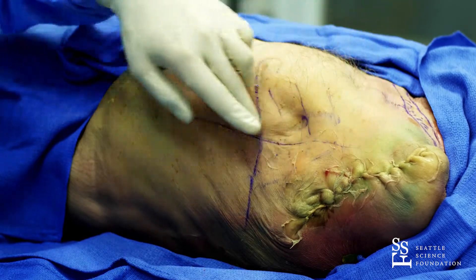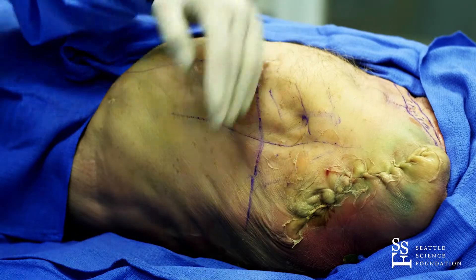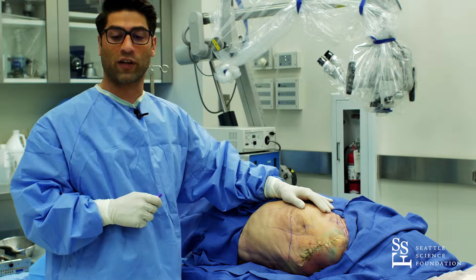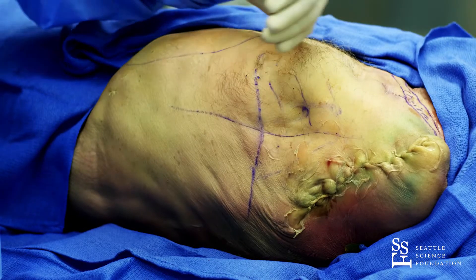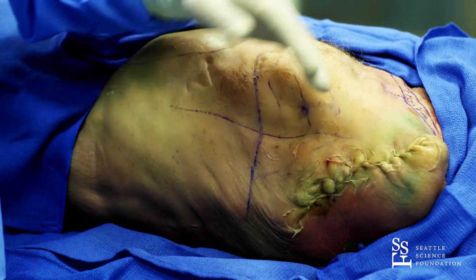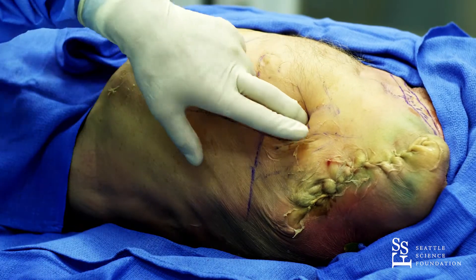For a permanent or temporary chest tube, you use the technique according to Bülow, where you go in the anterior axilla line with the mammular line as a border. Never go below the mammular line because the diaphragm is curved and it's very easy to get into the abdomen and potentially injure the liver or spleen. Always stay above the mammular line, use the anterior axilla line as guidance, and count — beginning from the clavicle — the fourth or fifth space between the ribs as your entry point.